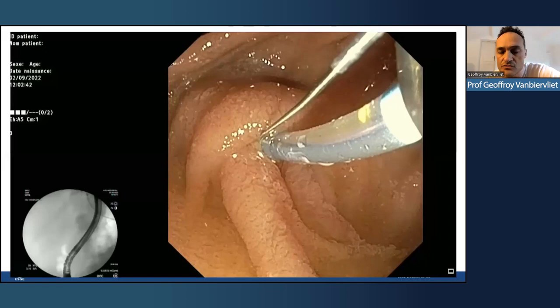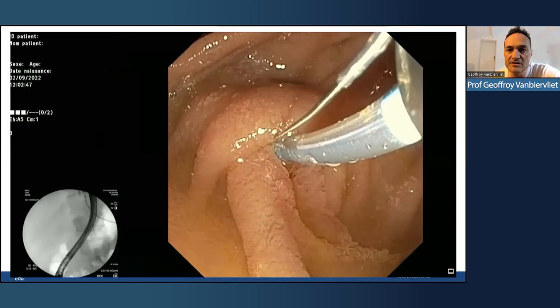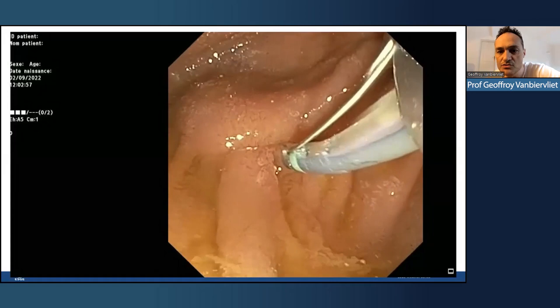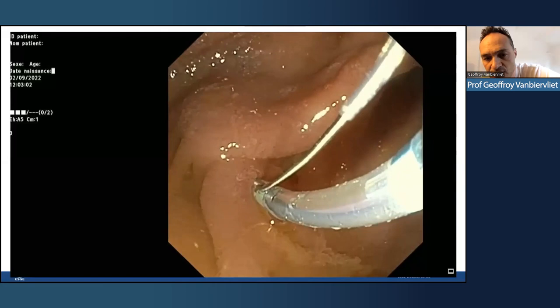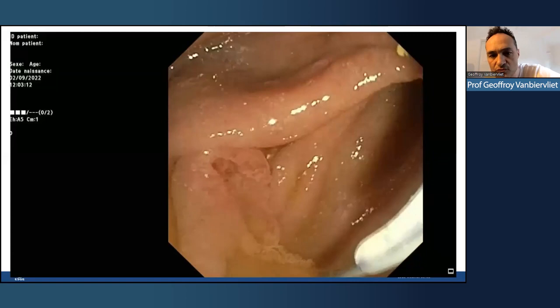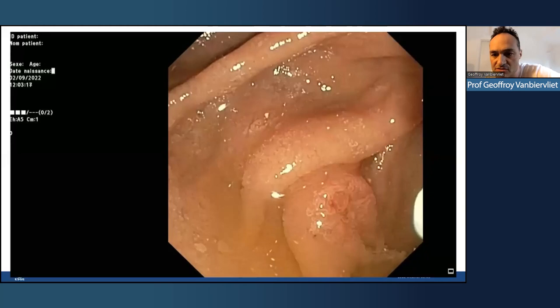It means that I try to have a good orientation at 11 o'clock with the sphincterotome using the bowing capability of the papillotome. And you can see that it was difficult and it was first a failure. Even when we tried to use the tip of the guide wire, and it could be an alternative to introduce your material inside the common bile duct. You can use only the tip of the hydrophilic guide wire, try to find the good orientation and the bile duct. So you can see that sometimes it is not so easy.